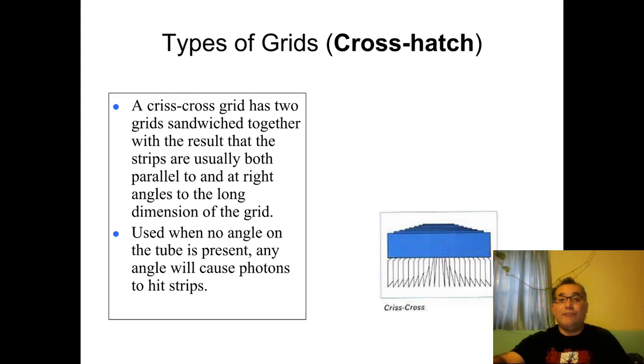Cross grids, we have some in the lab, and we will practice using some of them, but they are, in practice, very limited in terms of latitude with which to move your tube around. They would be very difficult to use. However, if used correctly under the correct circumstances, they would provide a very good scatter cleanup and thus very high contrast.